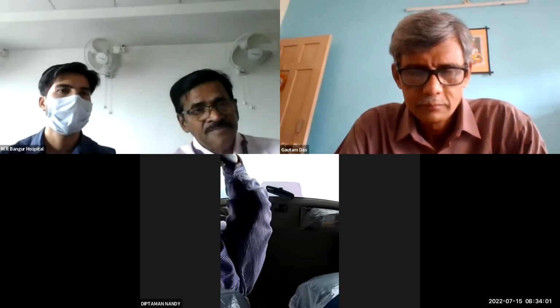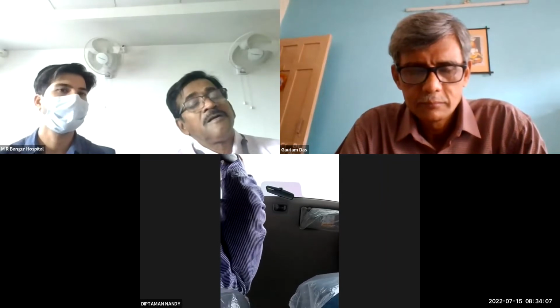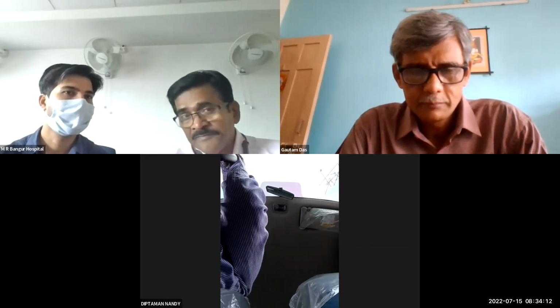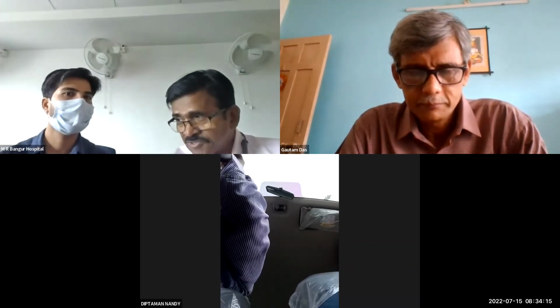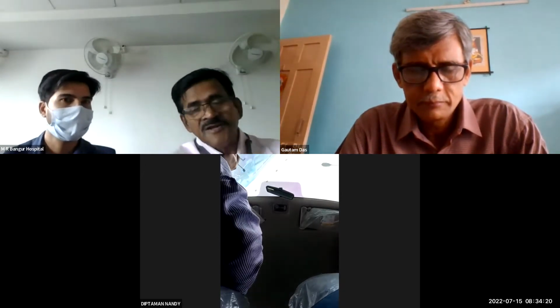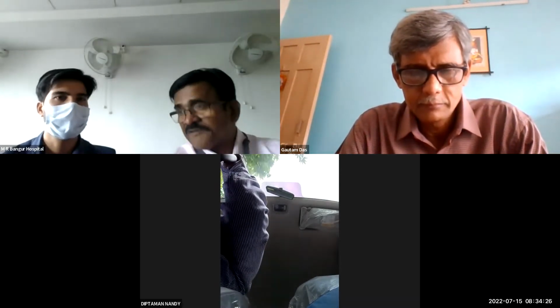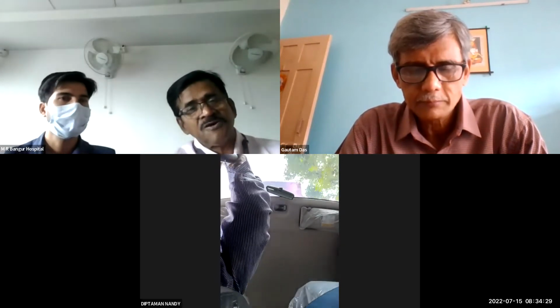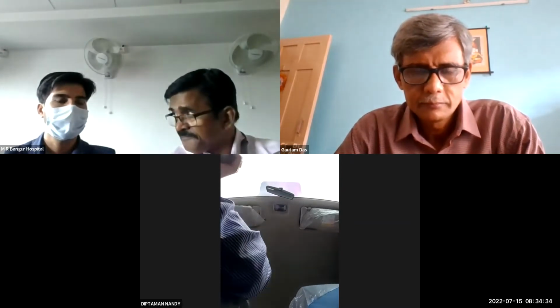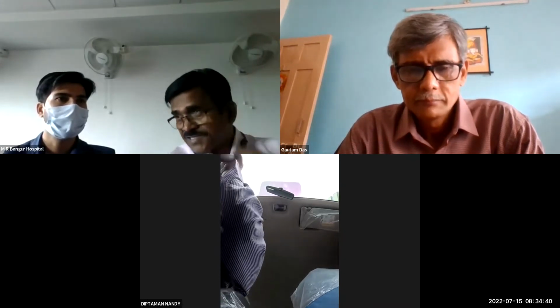What do you do first? So first we will look at the operative site. No, don't go to the operative site. You have inserted the blind trocar. So the first thing you do with the telescope is look at the site of entry of the first trocar for any bleeding, any gut injury, or any vascular injury. So the first thing on insertion of the telescope is to inspect the area of first port entry and exclude any injury. If it's not there, then focus on the area of interest.